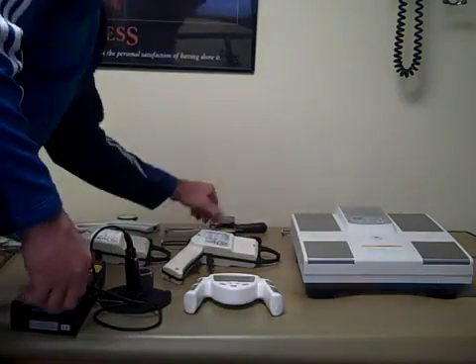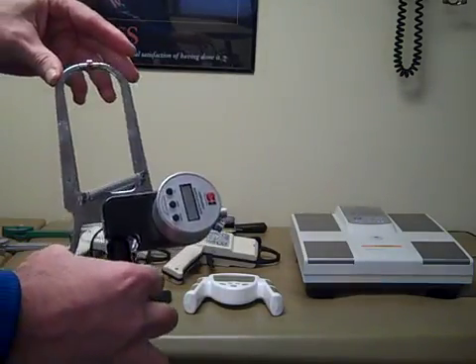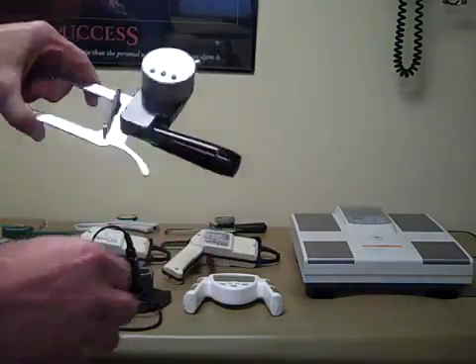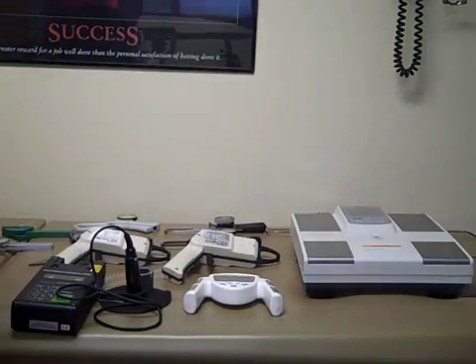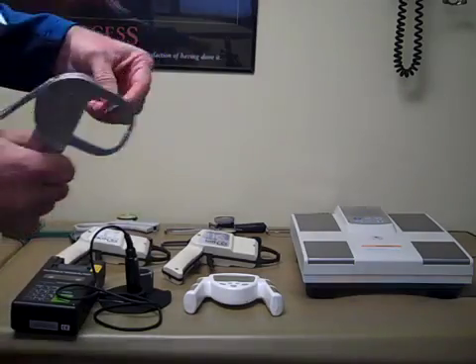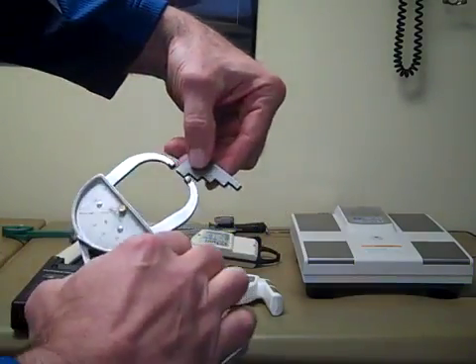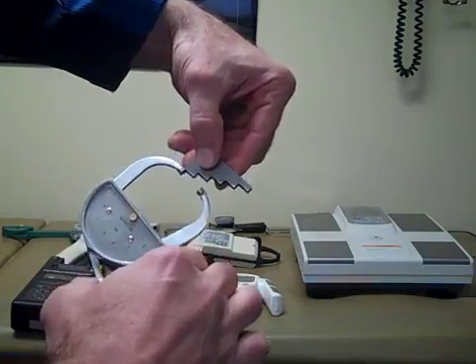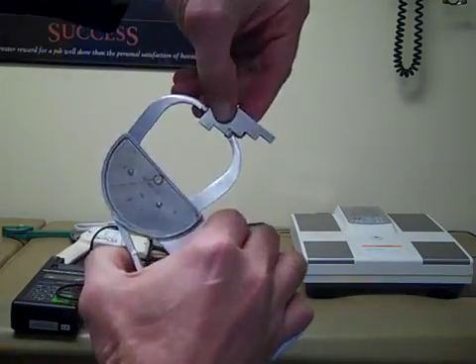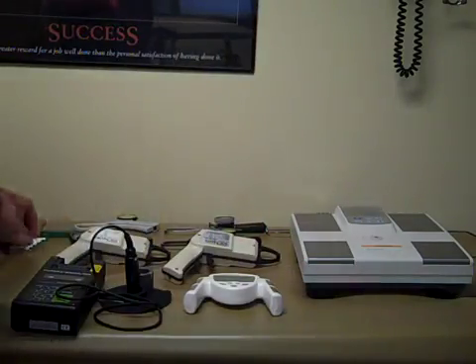They actually even make calipers with built-in computers that can do the assessments using a computer algorithm that is built in. All calipers from the manufacturers might include a calibration block. On the calibration block you can take your measurements and check the accuracy of the caliper with the different settings.